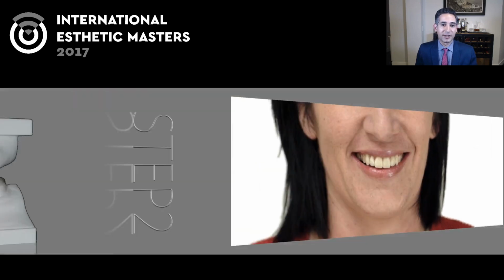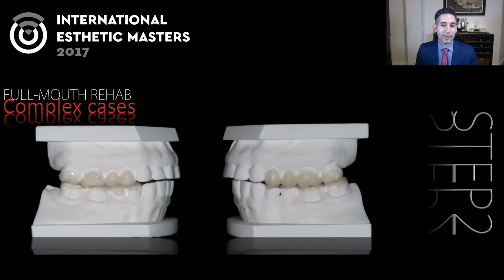So once we test this and we're happy with it, now it's time for step 2 as before, which is the functional vertical dimension and testing that. So in the approach that I do, I rely a lot more on indirect lab support, having things made, not using my chair time, and being ready to deliver chair side. I find less cleanup and the extra cost associated with that for me is worth it.